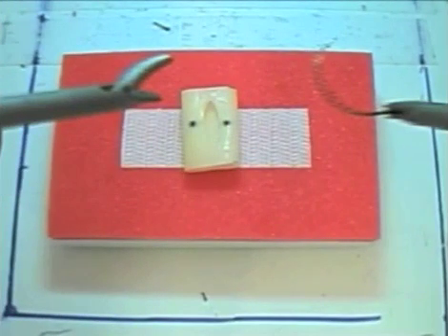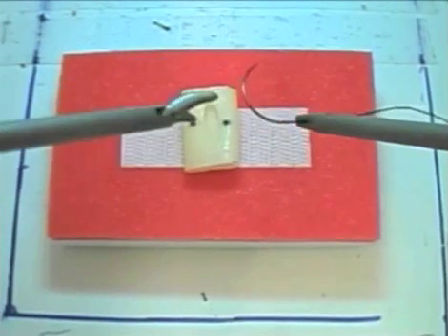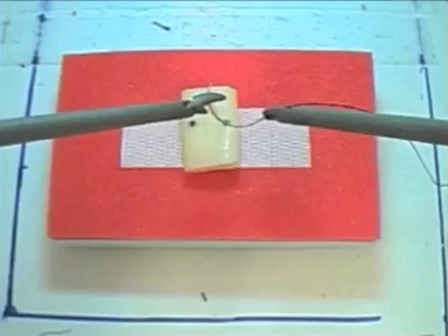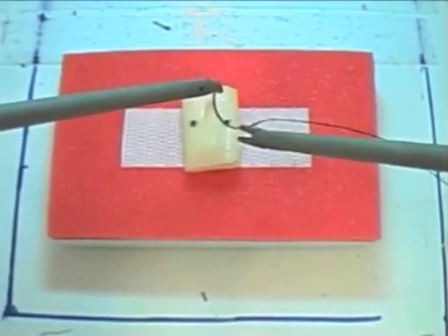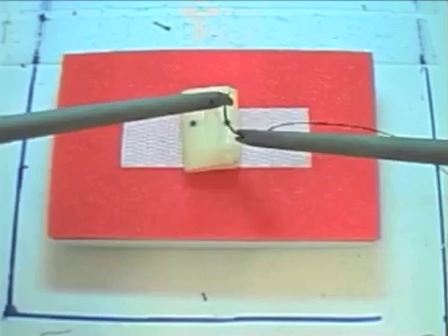Task five, intracorporeal knot. You will be given two needle drivers, one pair of laparoscopic scissors, and a short stitch. Again, the aim is to place the stitch within the area of the black dots.